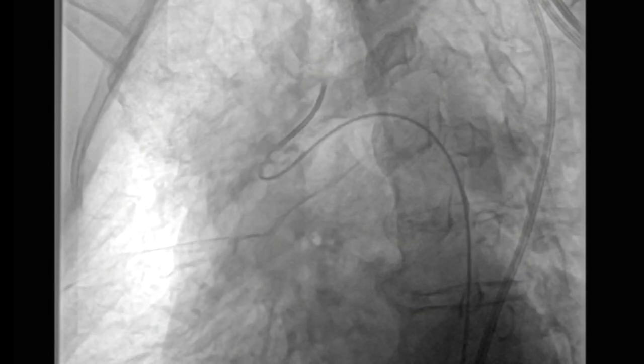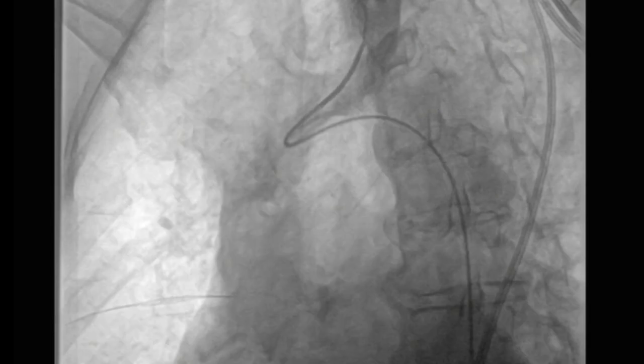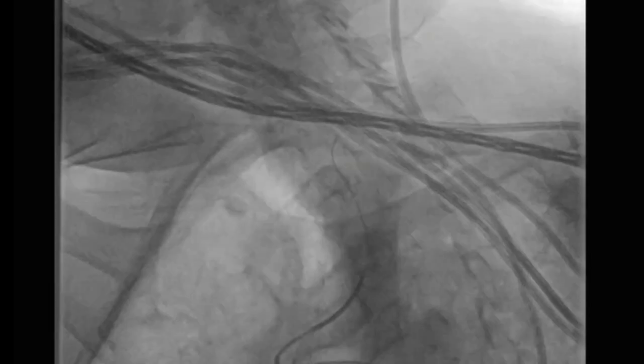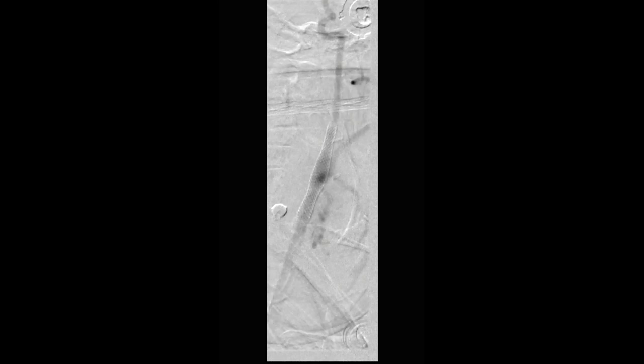As you pull it back, it's not completely in — you want to minimize this. Now it has popped into the origin of the carotid orifice and the wire has been advanced. You can confirm by performing an arteriogram to confirm you're actually inside the carotid.